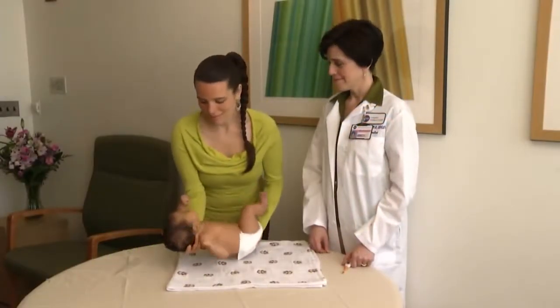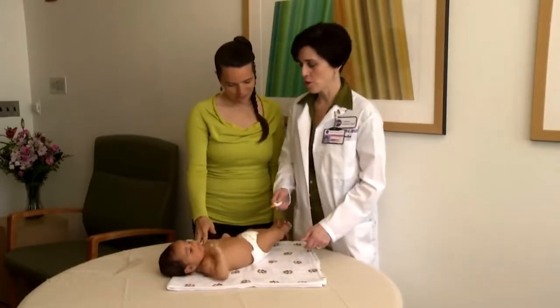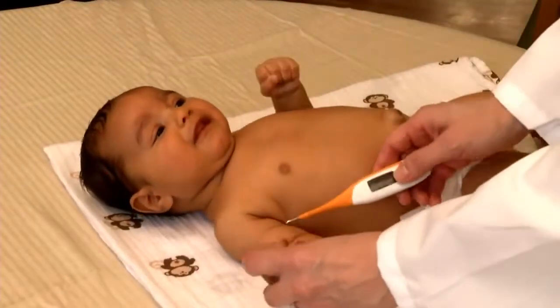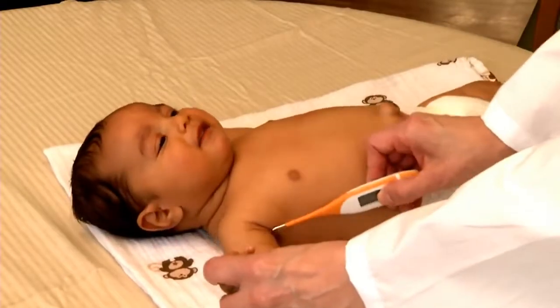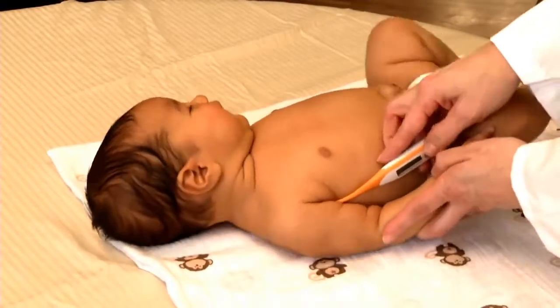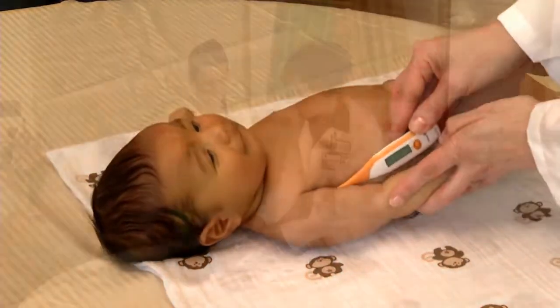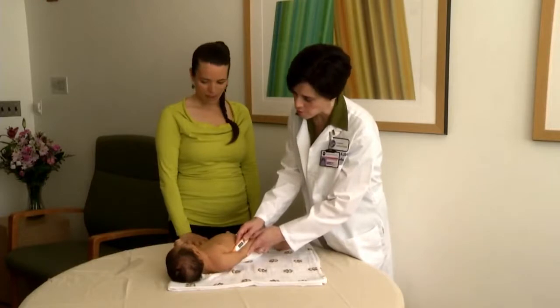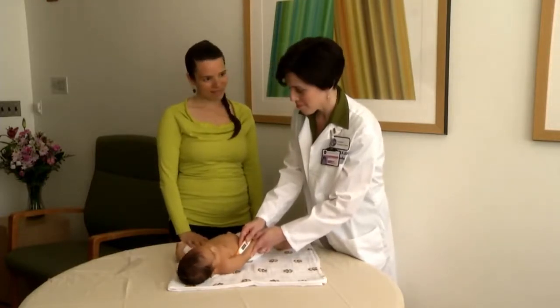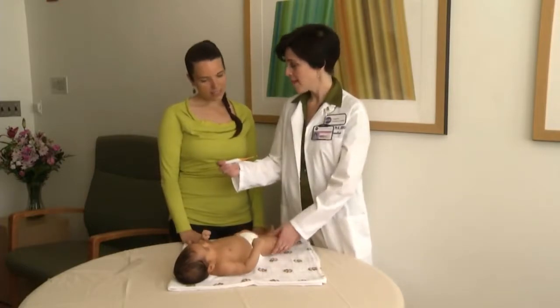To take your baby's temperature under the arm — the axillary temperature — lay the baby down on a firm surface. A table, a changing table, or a crib is fine. Lift one arm up and place the thermometer under the arm with the tip pressing in the center of the armpit. Now bring the arm down, making sure it is in line with the thermometer. Gently hold the arm down until the thermometer beeps. After it beeps, take it out and read the temperature, making note of the reading.